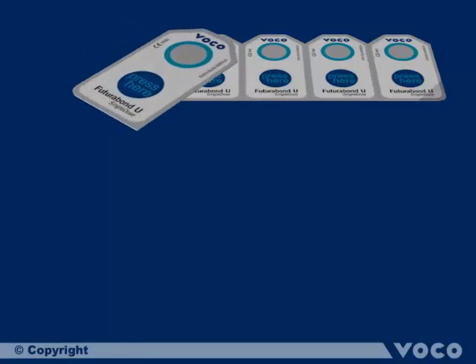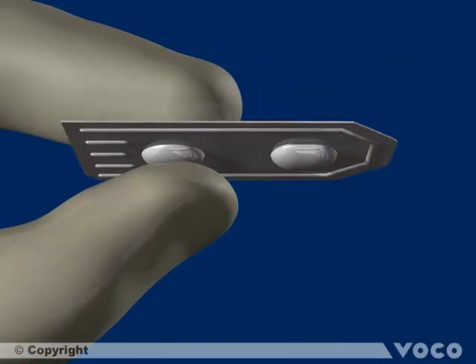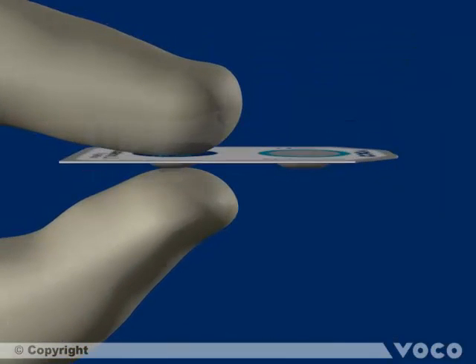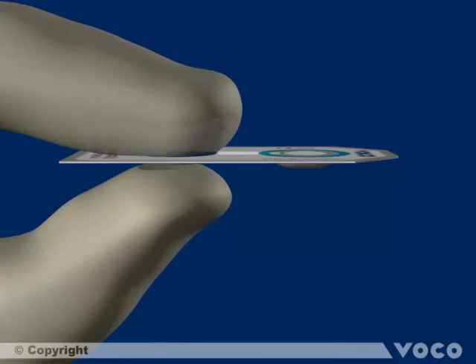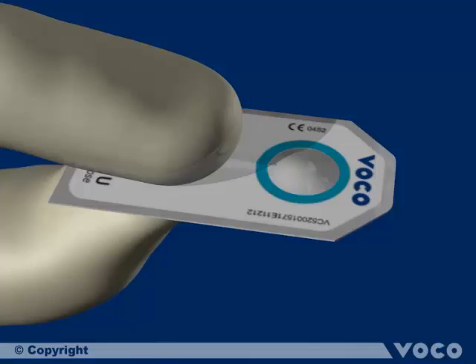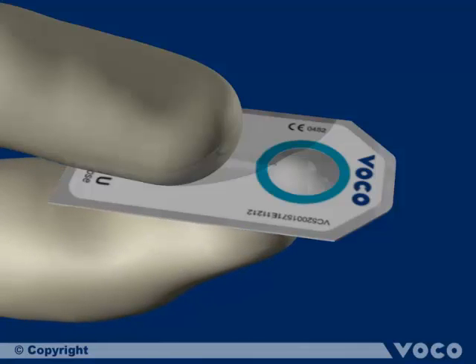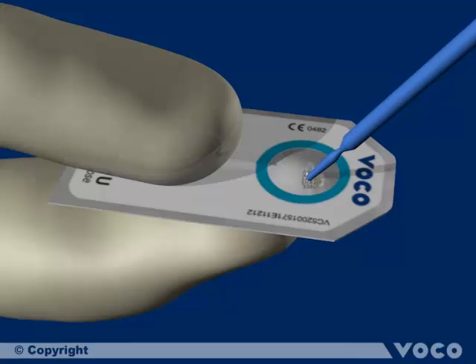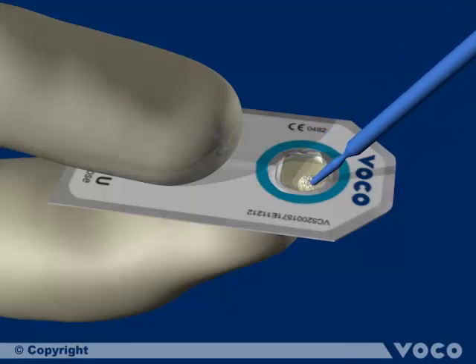Activation of the Futurabond U blister by pressing firmly between thumb and forefinger. Breaking the seal of the protective foil with an applicator, mixing until the liquid is homogeneous and completely wets the applicator.